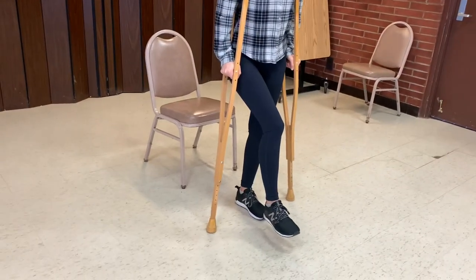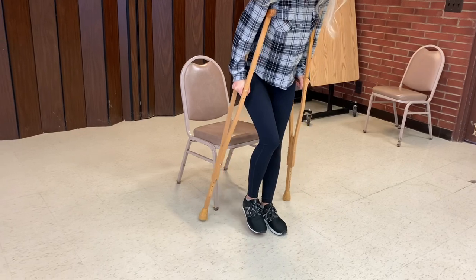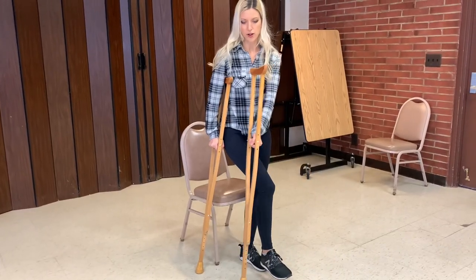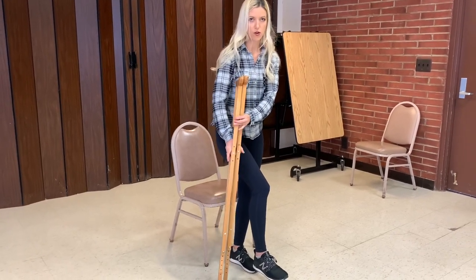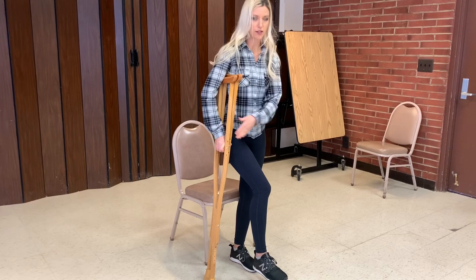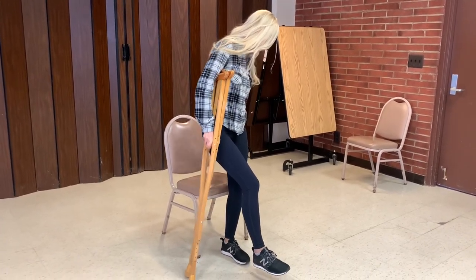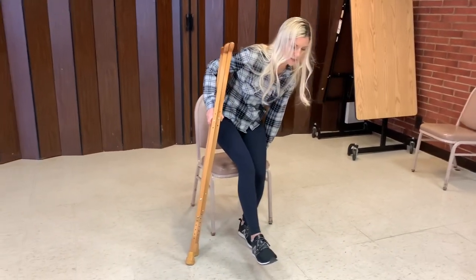Okay, so next I'm going to demonstrate how to sit back into a chair with your crutches. Okay, so keeping your affected leg up, you're going to back up into the chair until you can feel it behind you. And then you're going to bring the crutch around to the injured side, holding them both in the same hand. And you're going to reach behind you, either grab the top or the seat of the chair, and lower yourself down.